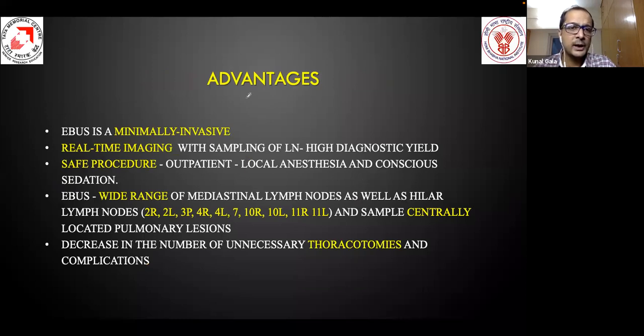So coming to the advantages of EBUS, it is a minimally invasive method. It is real-time imaging, because we are doing bronchoscopy as well as ultrasound at the same time, and it is real time since it is an ultrasound guided procedure. It is a safe procedure. It is an OPD procedure. The patient can go home after the procedure. Just local anesthesia and conscious sedation are given.